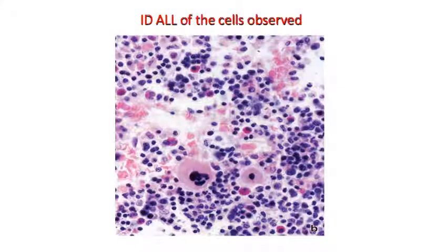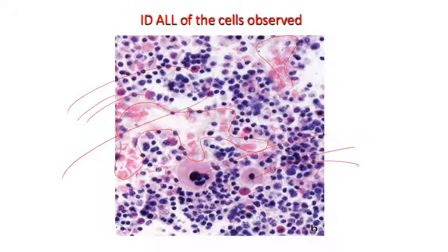Cells, we've already looked at this slide, megakaryocyte. We have our sinusoid right here. We have another sinusoid, it's a big one. Essentially, all of these red blood cells and wherever the lumen's at, okay? We have a site of lymphopoiesis, a really big conglomeration. Really nice example of an eosinophil. Okay, do we see any basophils? Let's see here. I don't see any basophils just readily. If you find one, great. I didn't find one, but they're in there.